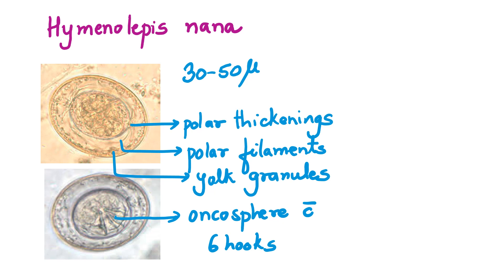H. nana: the egg is about 30 to 50 microns in size. It's rounded. You can appreciate there is an outer shell and an inner shell. Between the outer and inner shell, you can see polar filaments — small filaments originating at the poles from polar thickenings. We can also appreciate some yolk granules between the two shells. Inside the inner shell, we can see the onchosphere which has six hooks, so it is also called the hexacanth onchosphere. So H. nana: 30 to 50 micron sized eggs. Very important morphology — polar thickenings, polar filaments, and yolk granules between the two shells, and the hexacanth onchosphere inside the inner shell.